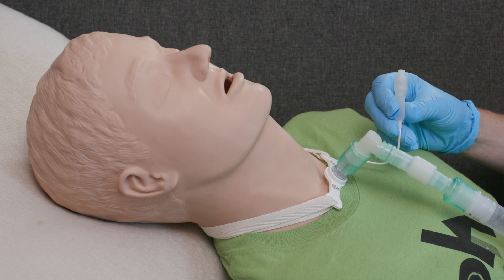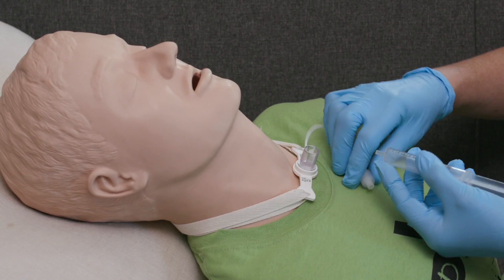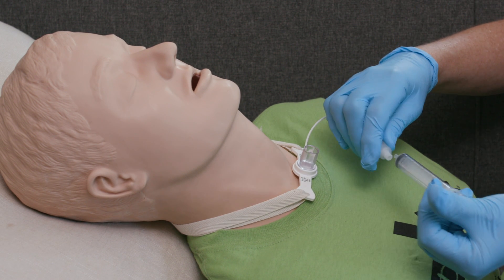If it is a cuffed trach tube, check the patient's care plan. Typically, cough assist therapy requires that the cuff be inflated to maintain pressure in the airway.